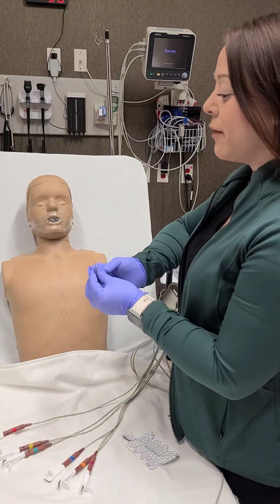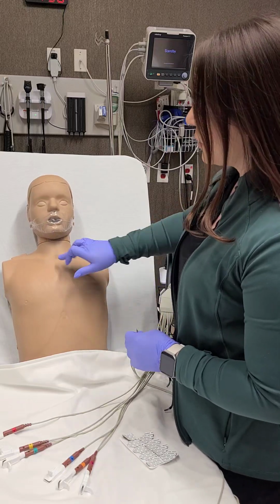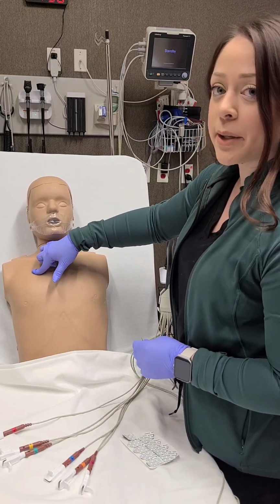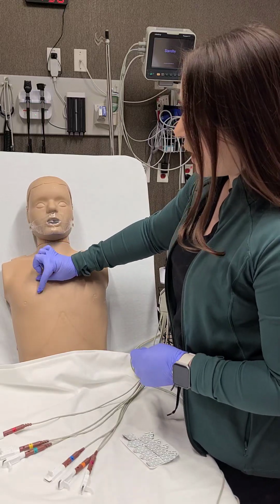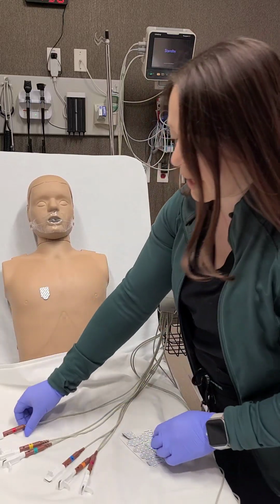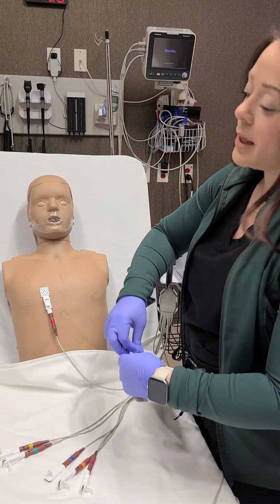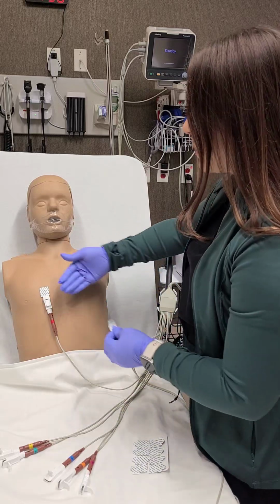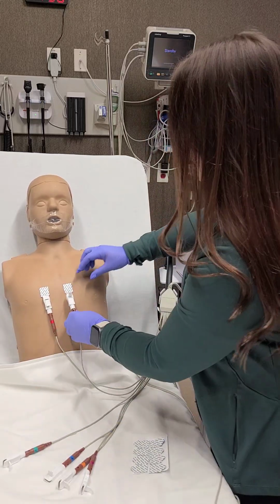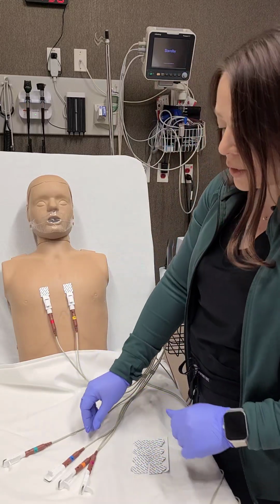V1 will be going in the fourth intercostal space on the right side of the sternum. To get to the fourth intercostal space, feel for that sternal notch there. Go to the right side, and that's space number 2. Go down to 3 and 4 and place right next to the right side of the sternum. That's going to be your V1. V2 is going to go in that same fourth intercostal space, but on the left side of the sternum.